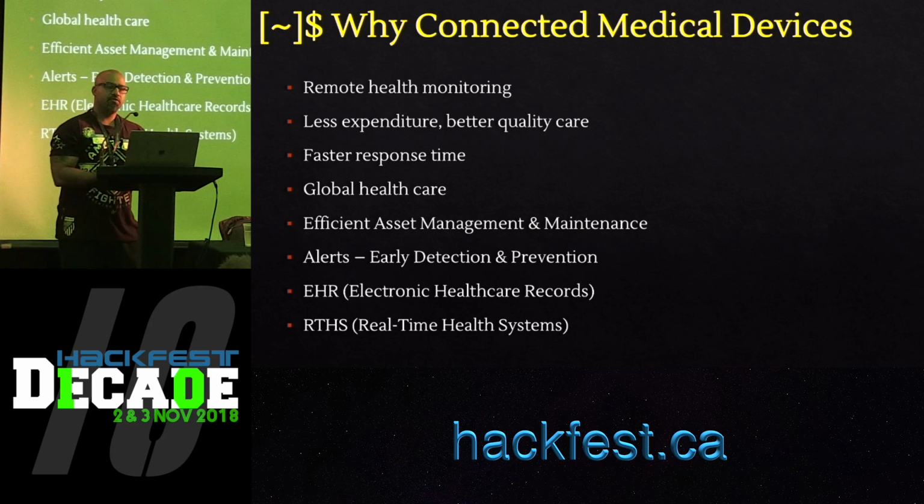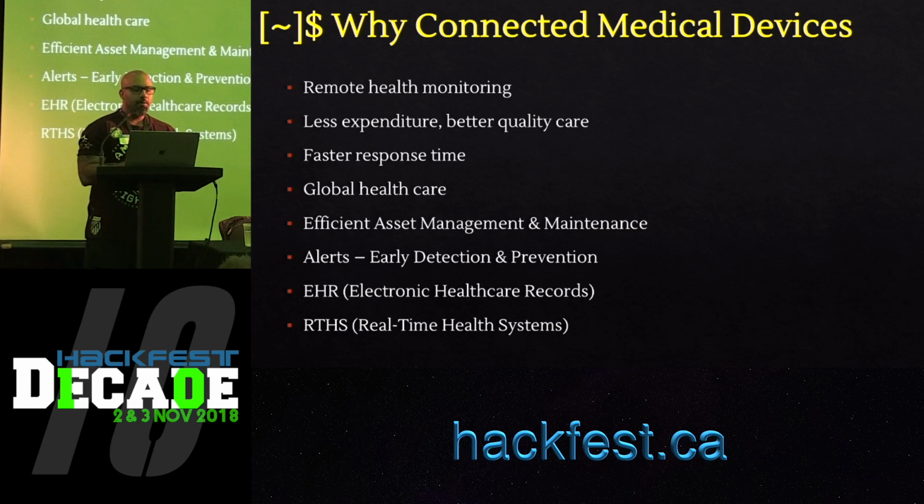Global healthcare is another big factor, and it's not happening that much right now, but think of the application of connected medical devices in underdeveloped countries where medical staff is always a scarcity. Since all these medical devices are connected to a central system, it becomes very easy to maintain them and upgrade them if need be. Alerts: for example, the insulin pump is monitoring the patient's insulin levels, so if it sees a deviation from normality, it can inform the patient, and they can take preventive action based on that alert.